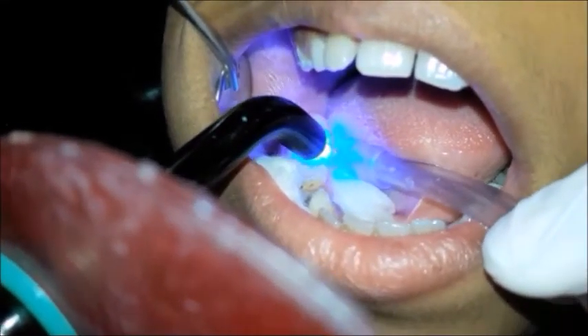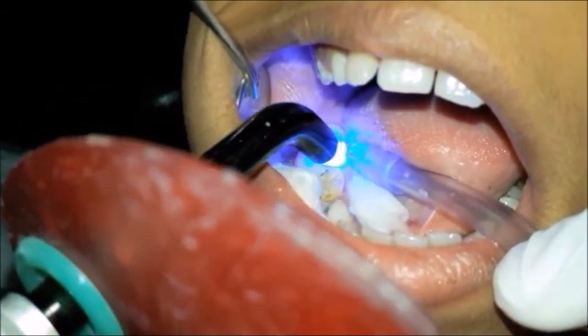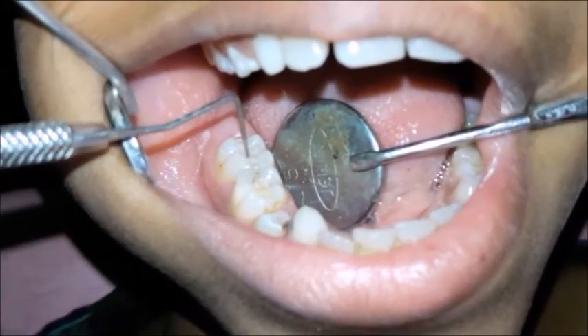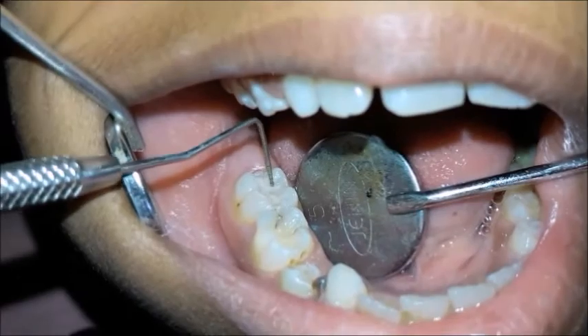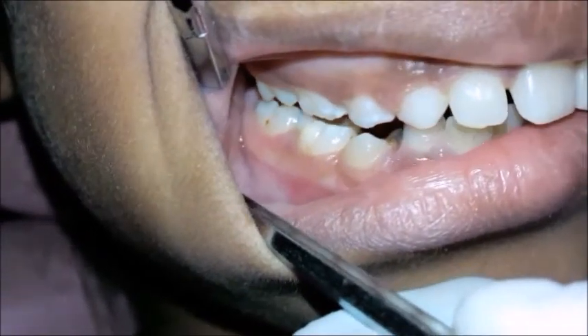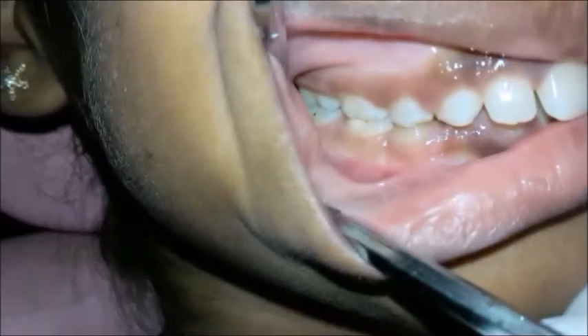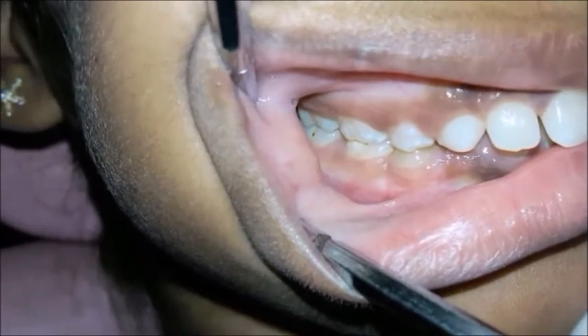The sealant is cured with the help of LED light for 30 to 40 seconds. Isolation is maintained during curing of the sealant. The property of this pit and fissure sealant is to change its color upon curing. We should check for any high points by asking the patient to chew several times. The patient is then recalled for follow-up.